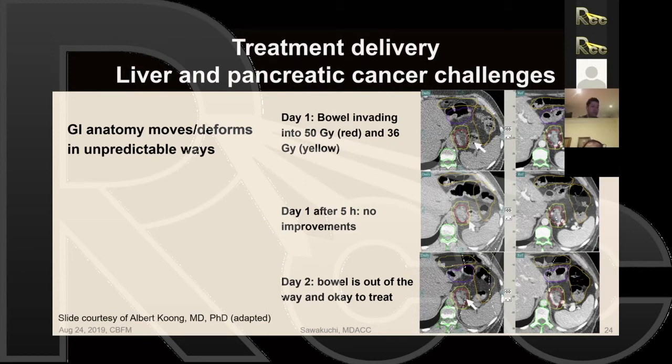One of the more recent developments is the MR, which I'm going to be mentioning a little bit more. In-room MR guidance is becoming increasingly adopted with the MR Linac and its various incarnations. The MR Linac does offer the capability for real-time in-room imaging while the patient is being treated. And we have actually run some test cases through that. We haven't actually treated anybody yet, but we hope to do so in the near future when we're able to do some breath hold based treatments on the MR Linac. And that, I think, will help us close the loop here, because there we can both look at intrafraction imaging in real time and also adapt treatment to account for daily changes in local anatomy and the tumor. Does that answer your question? Yes, thank you very much. Okay.